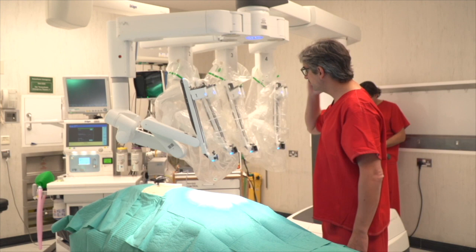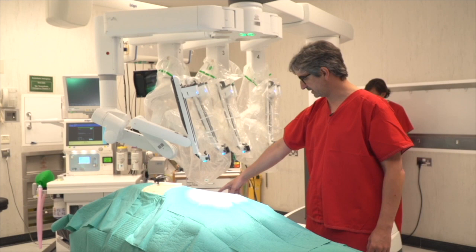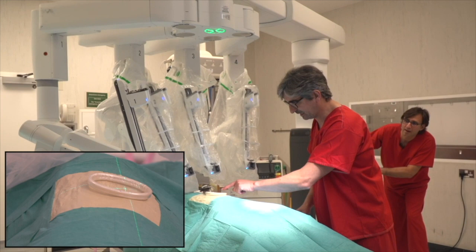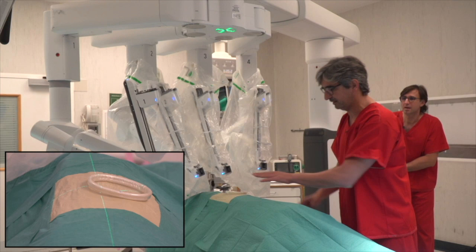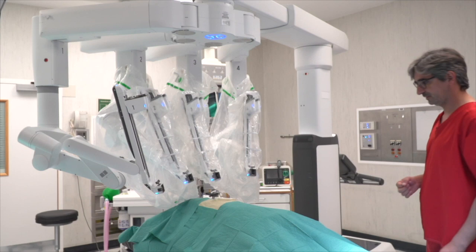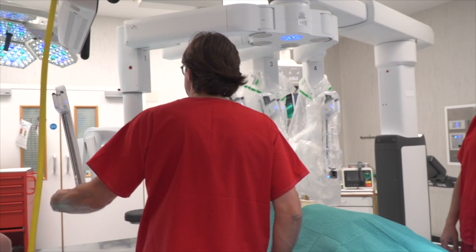It is very important now to move the robot with the laser. There is a laser here, you will see. Move. Just the cross should be in the upper part, here. You see the cross here, the laser. Deeper, more. Okay, stop. You can see here, perfectly place the cross on the posterior part of the incision. Very important. And now we will cancel arm one, for the right side, as far as possible, and back.